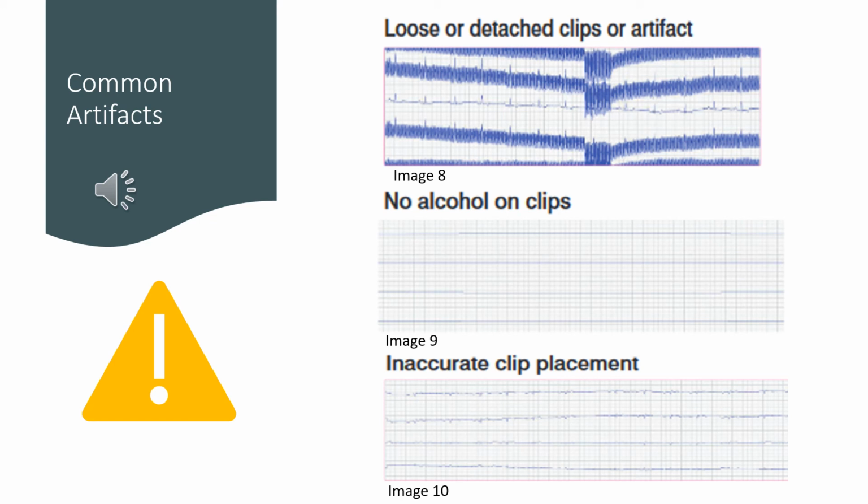A few other interferences that can occur are electrical interference from activity from a nearby machine, such as a pump or a cell phone. Patient movement can also mimic VPCs, so it is best to notate any movement on the ECG printout so as not to be confused later with a possible anomaly.